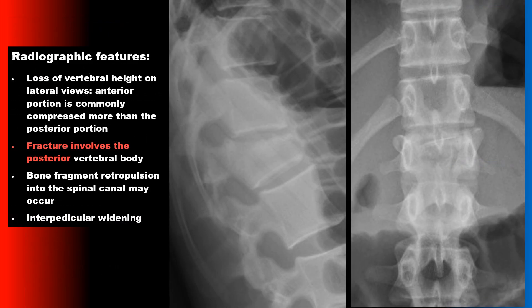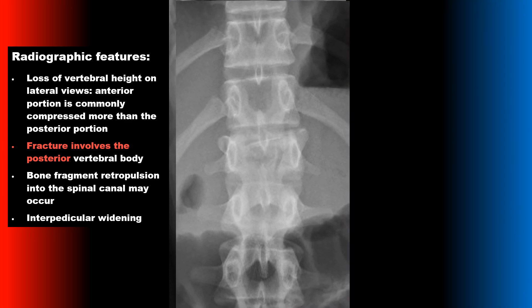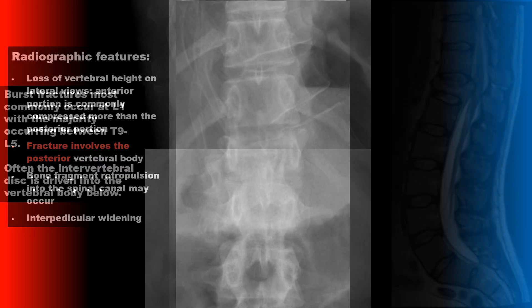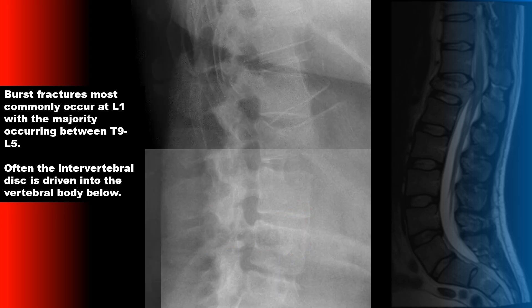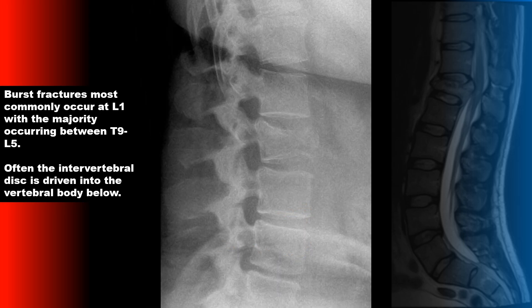The radiographic features of a burst fracture include a loss of vertebral body height on the lateral view — the anterior portion is commonly more compressed than the posterior portion. There can be bony fragment retropulsion into the spinal canal, and on the frontal radiograph you should see interpedicular widening, which is a widening of the space between the pedicles. Burst fractures most commonly occur at L1, with the majority occurring between T9 and L5. Often the intervertebral disc is driven into the vertebral body below.